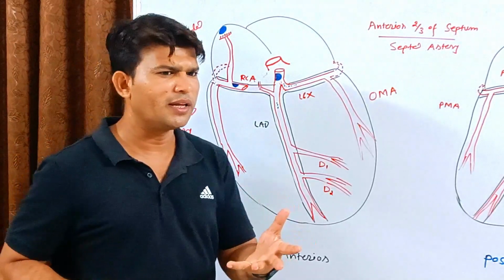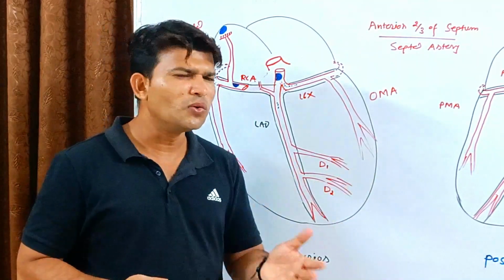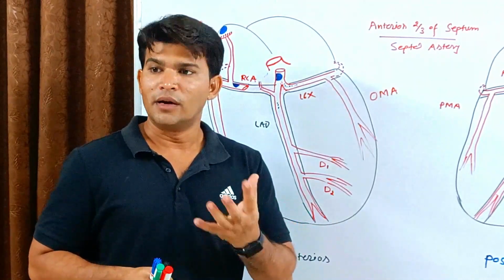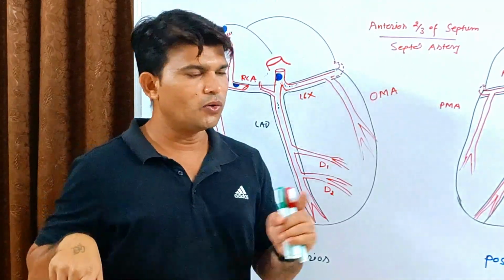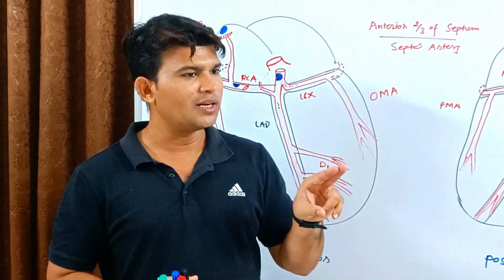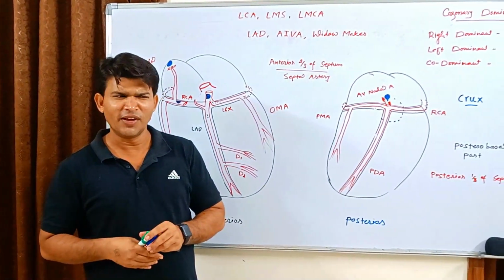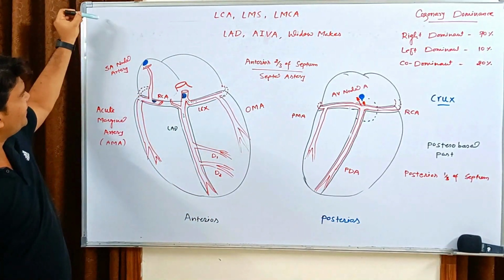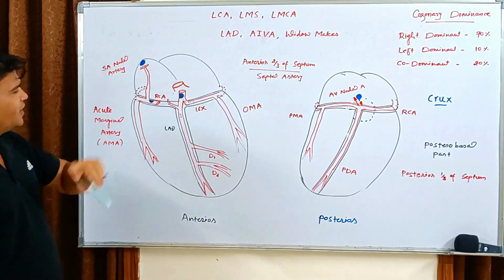We see so many such cases. There we have ST segment elevation from V1 to V6, and we know V1 and V2 are which leads? Septal. V3 and V4 are localized anterior leads. V5 and V6 are lateral precordial leads, right? V1 to V6, and in the horizontal plane, leads I and aVL are also lateral leads, right? And II, III, aVF are inferior leads, and what else? aVR basically looks into the right atrium. aVR is at minus 150 degrees, right? And looks straight into the right ventricle, right?